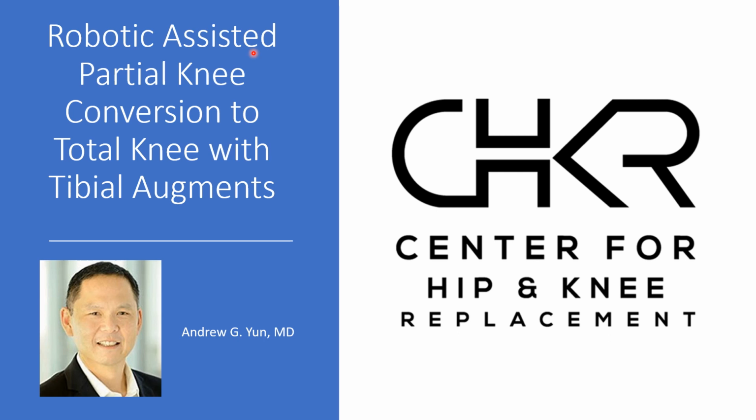And we're going to focus on three main concepts. One is how we deal with retained hardware and look for impingement to know whether we need to remove or whether we can retain hardware. Number two, how we deal with bone defects. And three, how we plan for the level of augmentation. So this is going to be more technical for those of you who are interested in this level of detail.